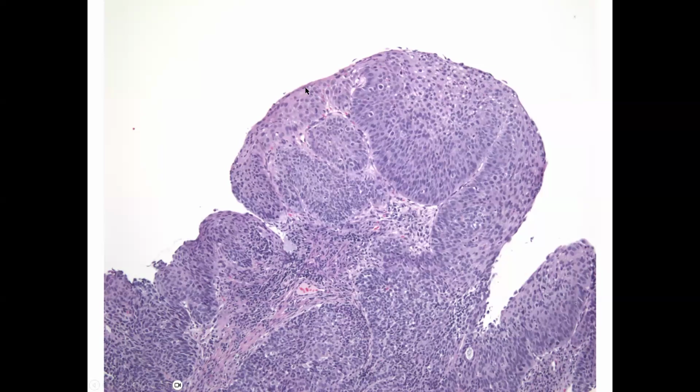There we go. Yeah, so in this area here, we can see an exophytic area that might endoscopically even look like a polyp. Again, we can recognize it as squamous epithelium, but there's really not the maturation that we would normally see. There's very little keratin production here, so this doesn't resemble the squamous epithelium we'd seen in the esophagus earlier.